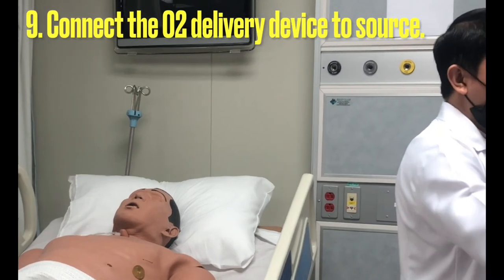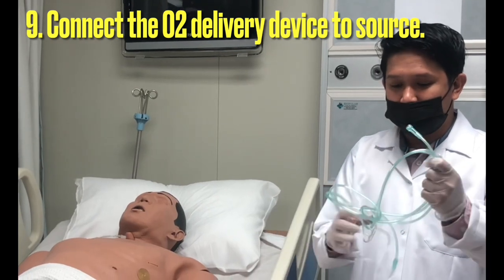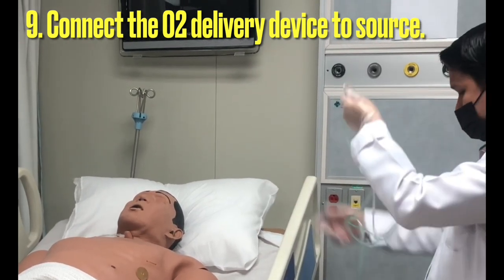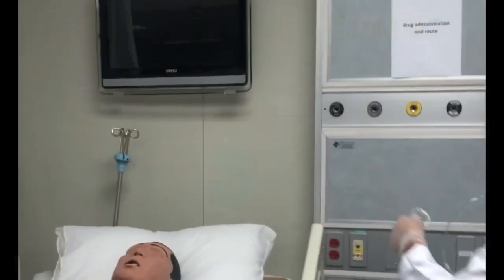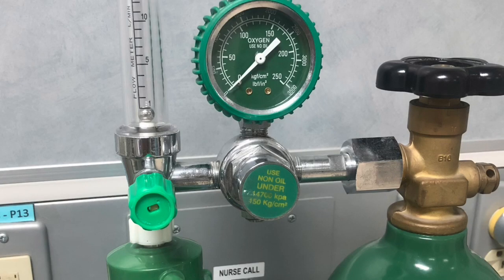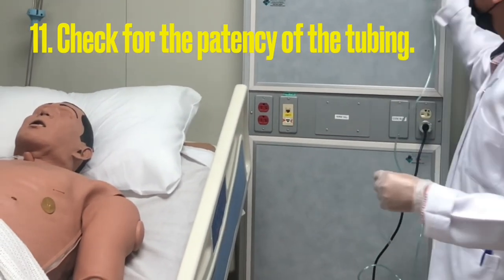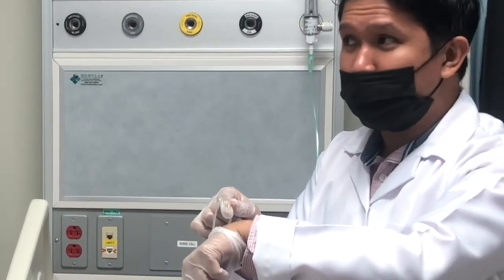Step number nine is to attach the oxygen delivery device to the oxygen source, and then turn on the regulator up to the level ordered by the doctor. After you open it, check for patency — that is step number ten. There should be a flow of air; you should be able to feel the oxygen coming through.